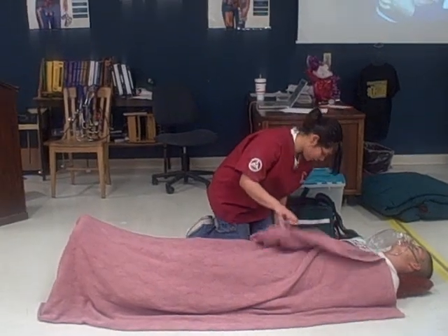I will apply oxygen. I will check for leaks and for pressure. There are no leaks. I am going to apply a non-rebreather mask. I will set it for 15 liters per minute.